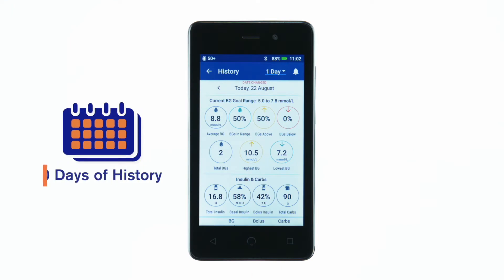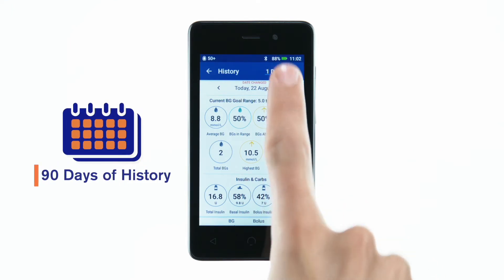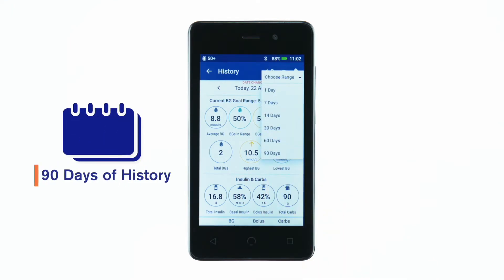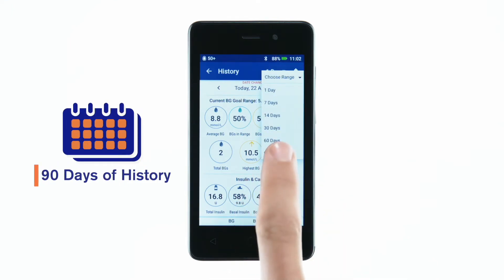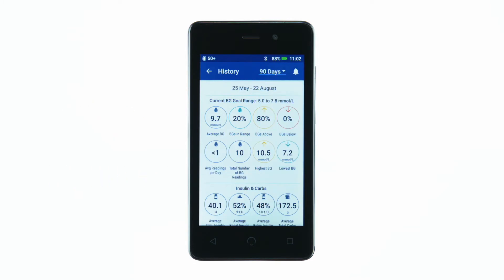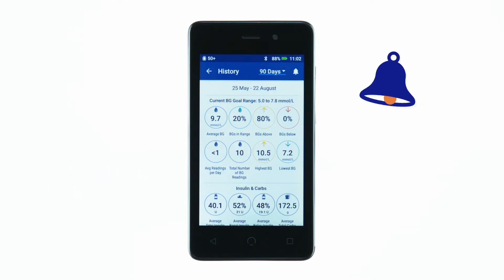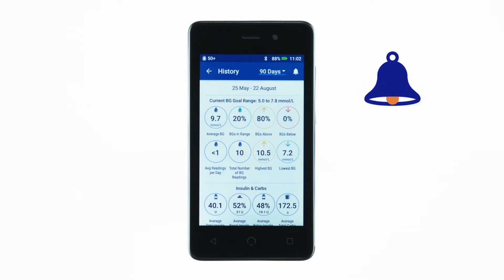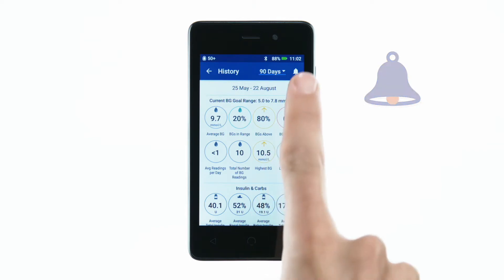The Omnipod PDM can store up to 90 days of history. To review past notifications and alarms, tap the bell icon in the upper right-hand corner of your PDM.